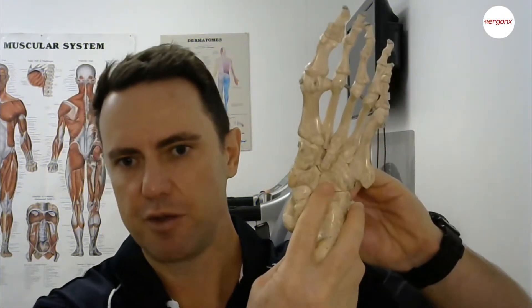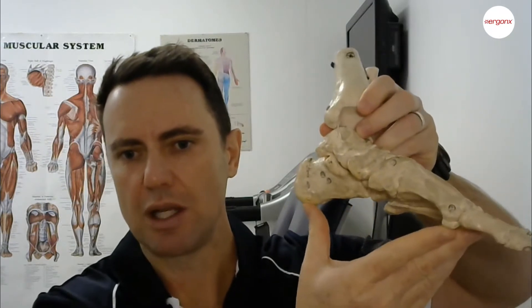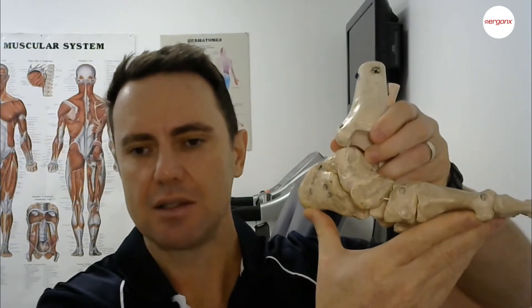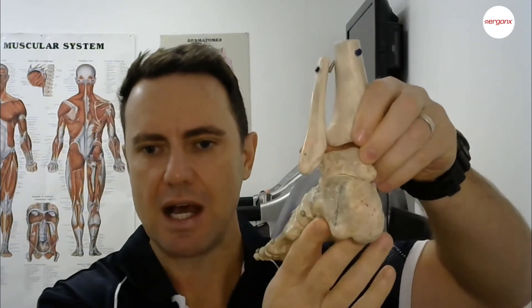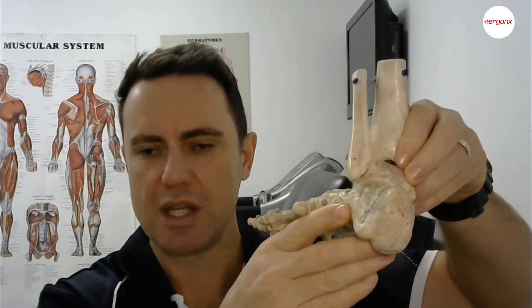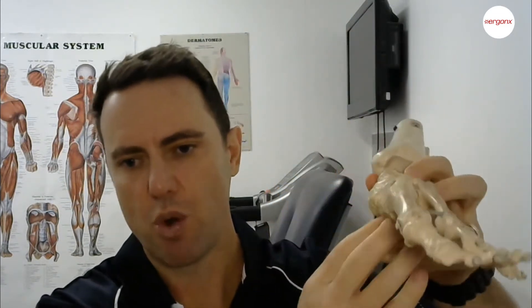How do orthotics help with flat feet is a question we commonly get asked in the clinic. Basically, what happens when you've got a flat foot is your arch collapses or flattens out. This is a left foot — we're looking at the inside of the left foot. When your arch flattens out or collapses like this, the heel also rolls towards the inside.